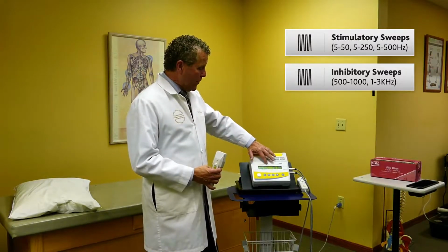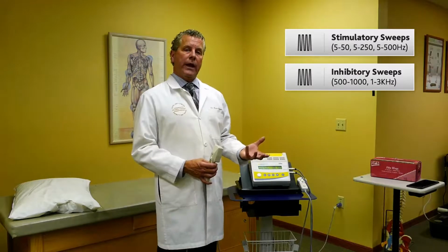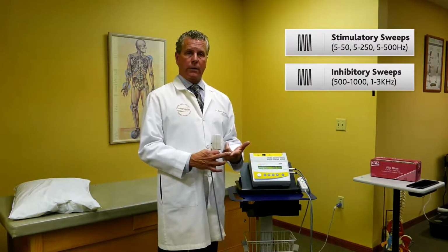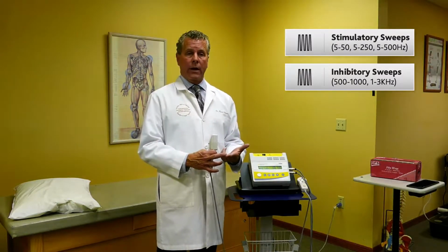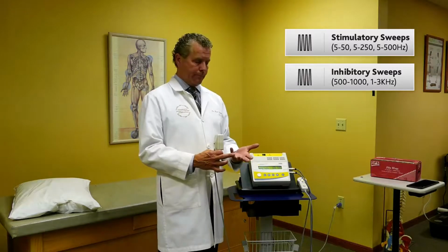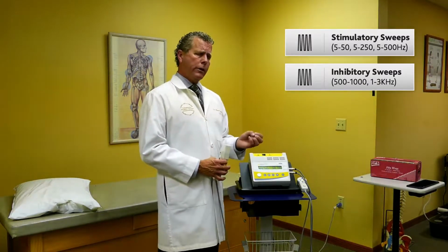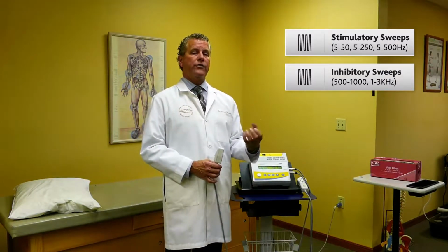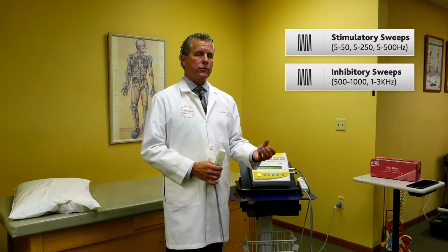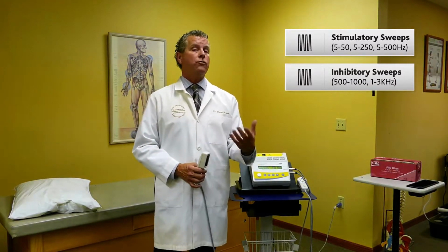If we're looking at 1,000 to 3,000 hertz sweep, we understand that we're inhibiting four major things. Pain, which is what brought the patient in. Spasm, typically they say they have very significant spasm. We inhibit edema and swelling. We really truly don't want to inhibit inflammation because inflammation is the precursor of cell regeneration or cell healing. So even though we're on this high frequency, sometimes we inhibit it, but that's not our major goal.